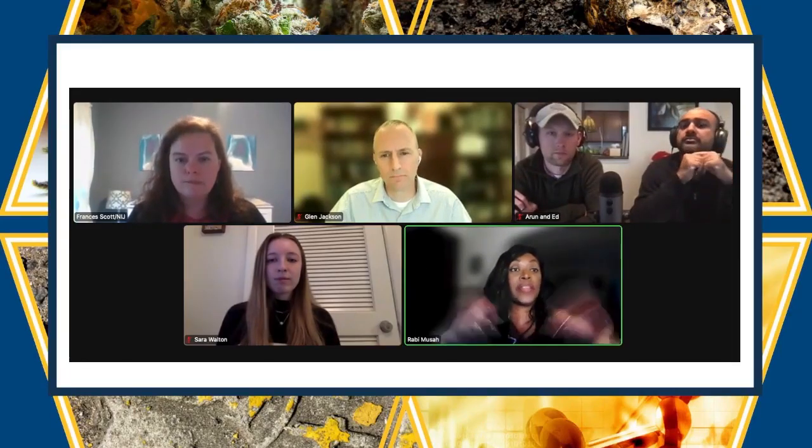So that's one tier. And again, this would be automated. And so the first thing you would do once you realize you have something new is to screen it against this user interface, this software. Then once it gives you that classification of what it is, so for example, a tryptamine, then there are two tiers of discrimination. You have a tryptamine, but as you know, it can be a methylene dioxy derivative, it can be a pyrrolidine derivative. So it'll tell you that I'm 98.2% sure that this is a methylene dioxy derivative. And then, so you go in knowing that, which is something that you wouldn't have had just flying blind.